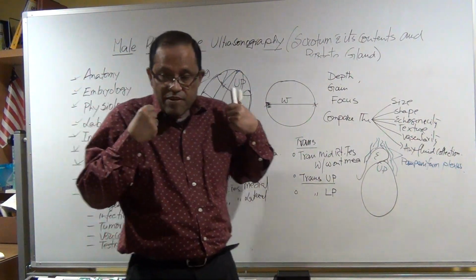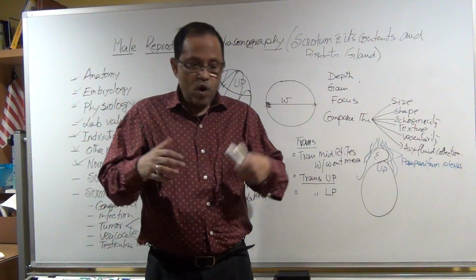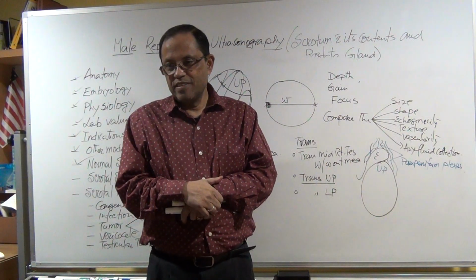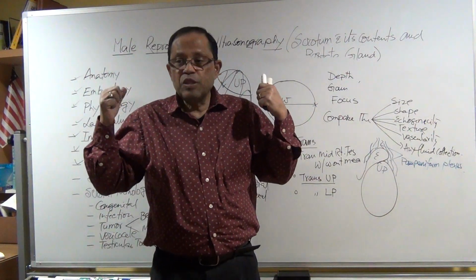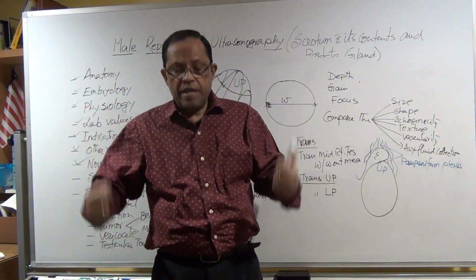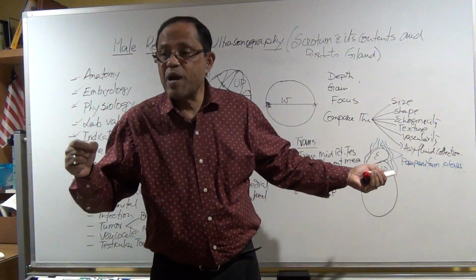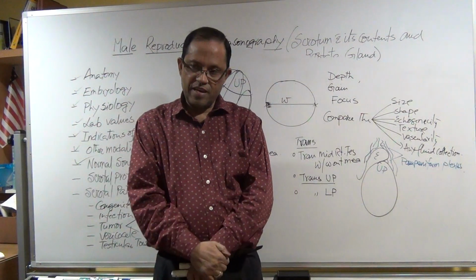Then do the Valsalva maneuver. What is Valsalva maneuver? And why did you do that? Because I feel like it could be a pathology. So then I asked the patient to do the Valsalva maneuver. And if you see, it was 1.5 millimeter, now it is 2.5 millimeter, the diameter of the vein.